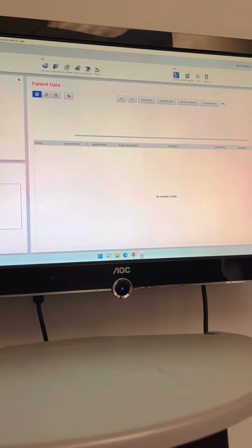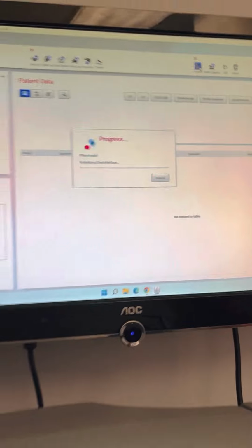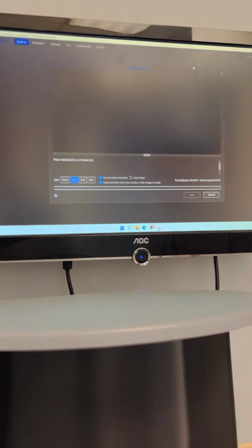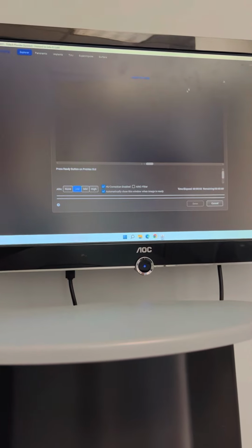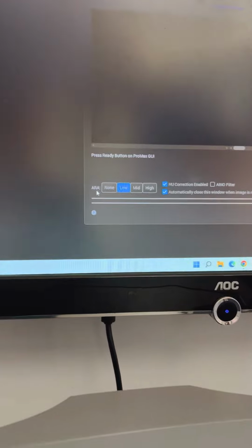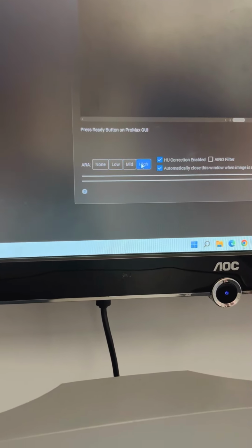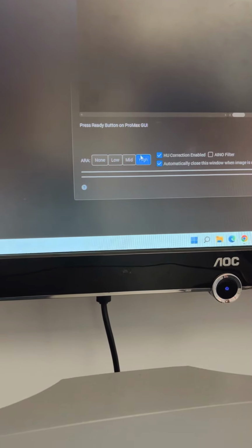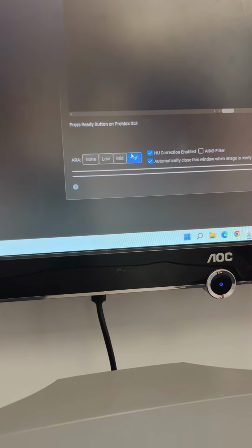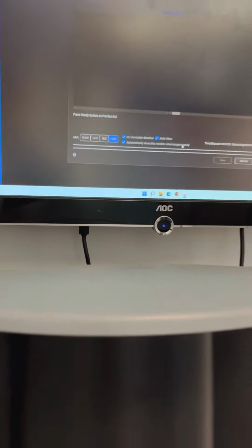The 3D capture button, we will click, and that tells the software that we're about to begin taking a 3D CBCT image. I would recommend, we may change this, but the artifact removal algorithm, the ARA setting, is set on low by default. For oral surgeries, you typically want to set this to high because you're usually dealing with metal opacities you want to clear up. I'm going to check this. Don't worry about this, it will become a default once we take this.